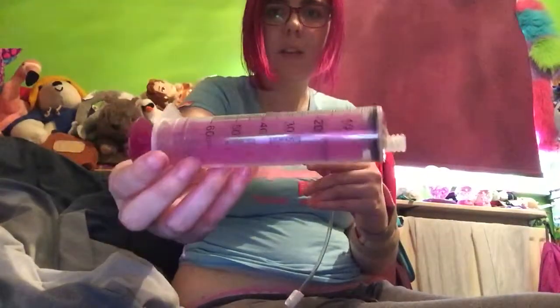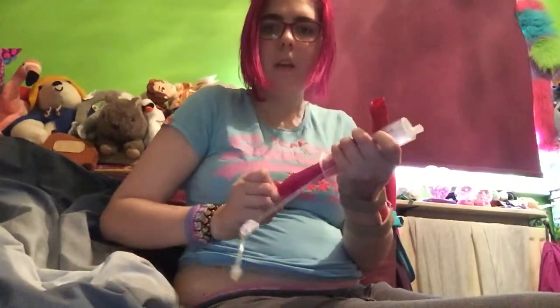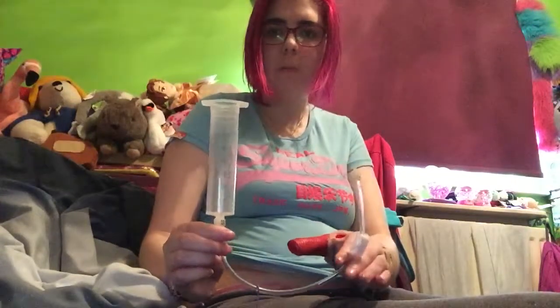So when you're going to feed, you take this connector like this, and you slot it into where the opening is, and then when you're going to feed, you attach the syringe like so. This is one of the bigger syringes. It's a 60ml syringe, and this is where we put the feed and the medications through. First off, you are going to want to take the purple pushy thing out and attach it to this. Imagine this is in the PEG now, and you're ready to feed, or you're ready to give medications. That is how it would look.